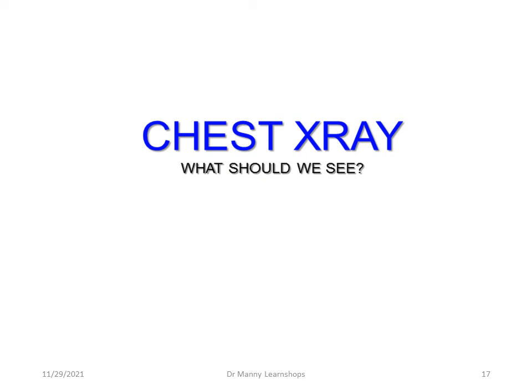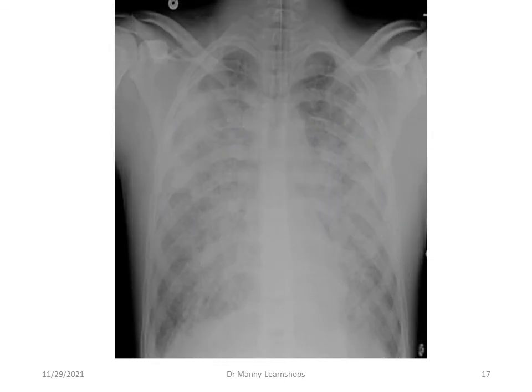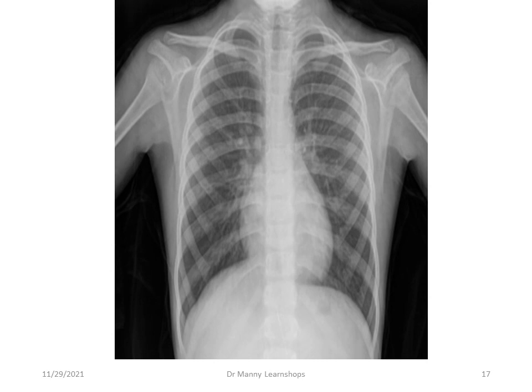Chest X-ray, what should we expect to see? Well, we should expect to see an improvement. Here we have the ARDS picture with increased infiltration, alveolar edema. We should expect it to improve. That's what we would like to see, a normal chest X-ray.